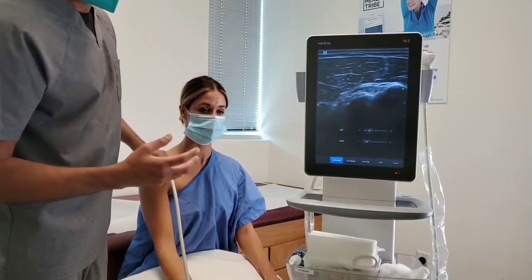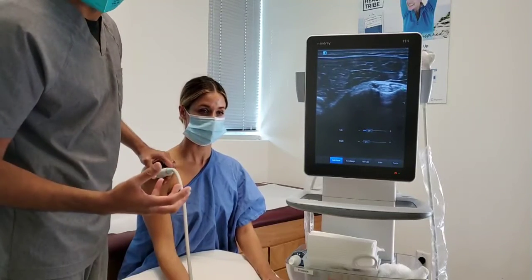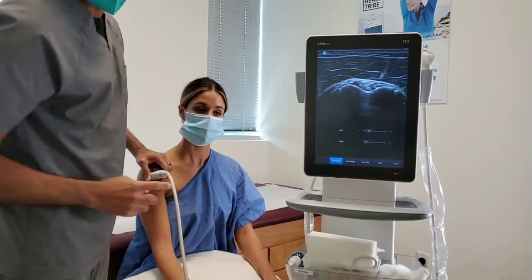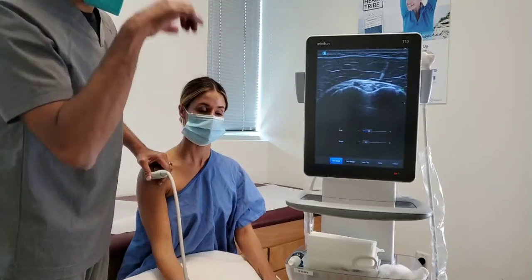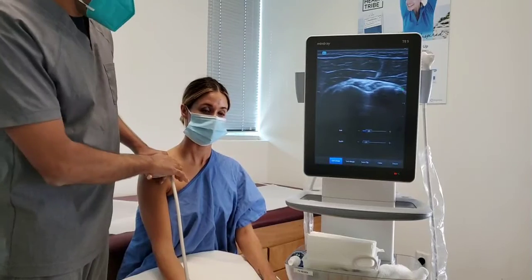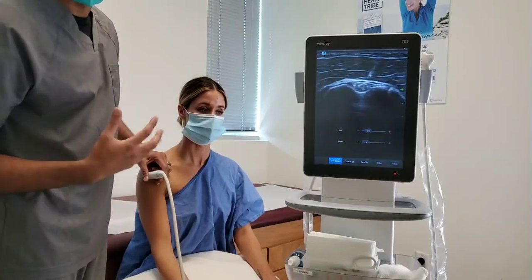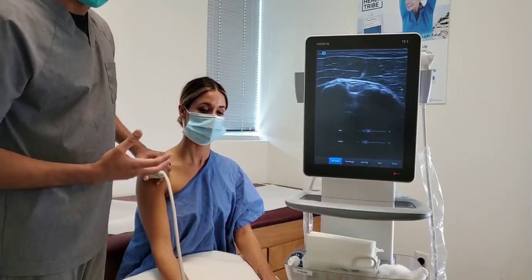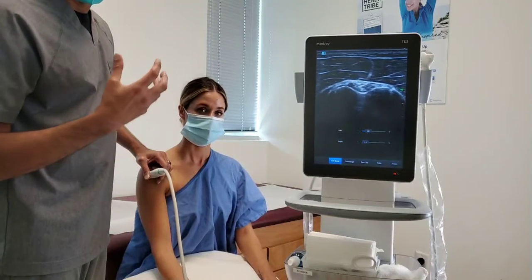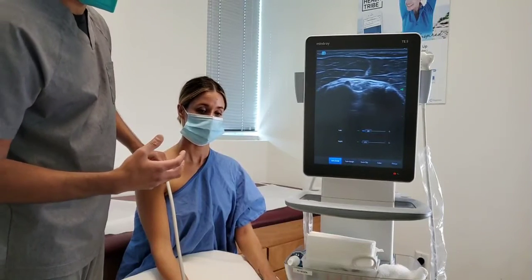And different structures have different densities, and the sound waves bounce off of different structures in different ways. For example, bone is bright white in ultrasound because all of the sound waves bounce completely off of the bone and back to the device. So everything below the bone, we can't actually judge what's going on there, and that's why ultrasound's not great at looking deep inside joints, because there's an issue with the sound waves actually being able to penetrate that deep.